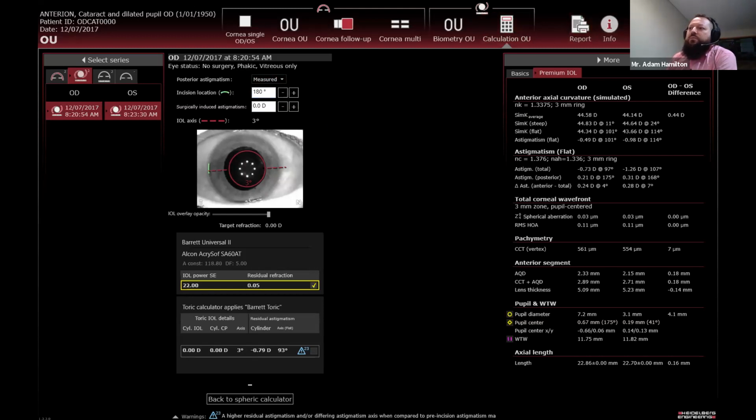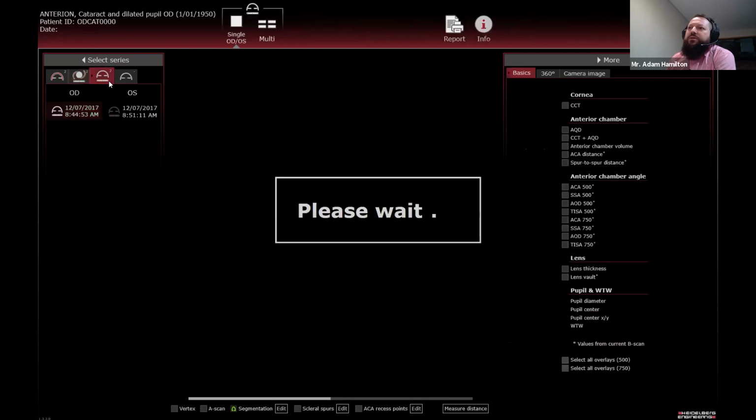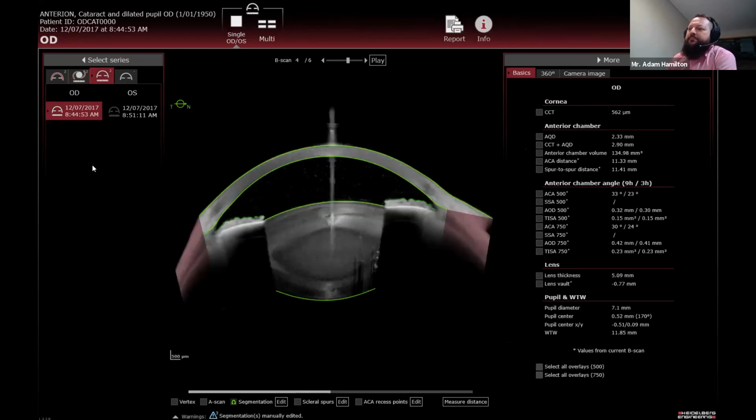Again, what you see on the screen is what you get on the reports. So you get all the alignment information, everything like that. If we go in and have a look through metrics, again, we can turn on all our overlays, select what we'd like.